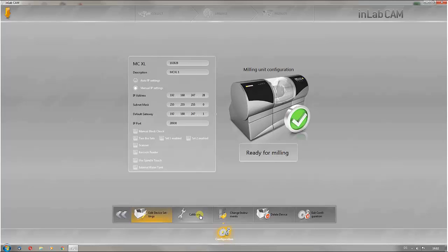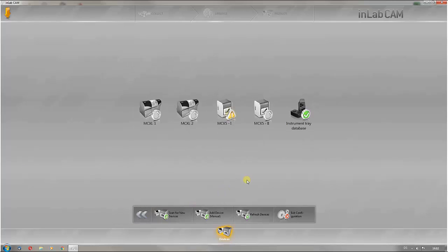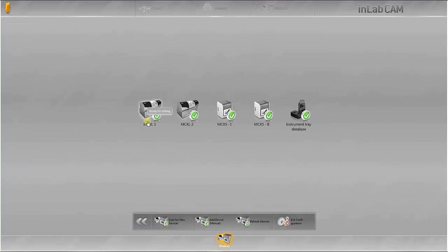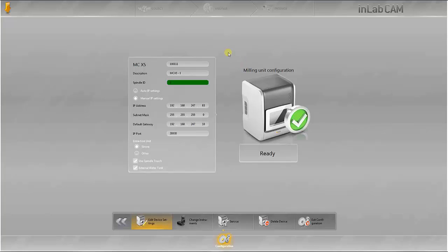You can also make individual settings for the InLab MCX5. As with the InLab MCXL, all the machine settings can be viewed in this window.